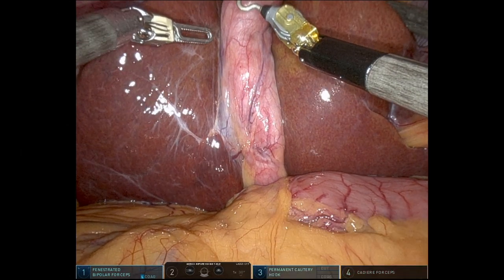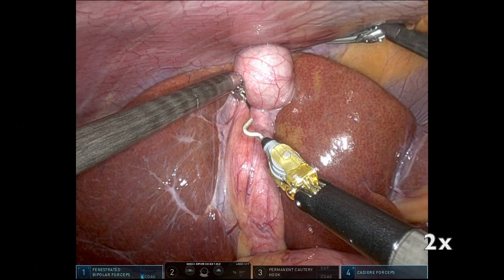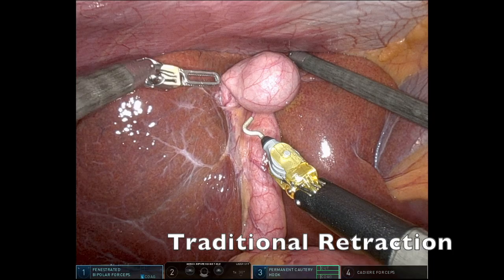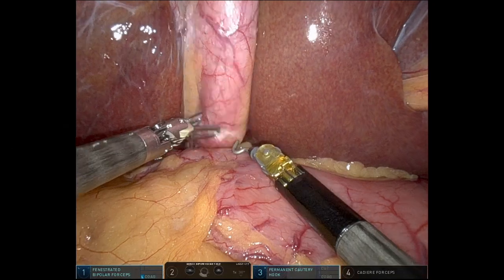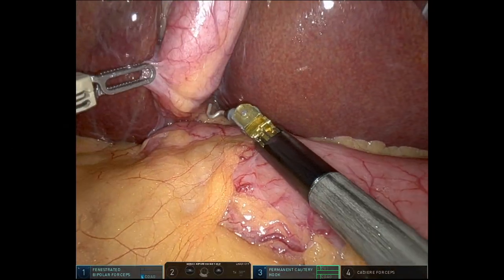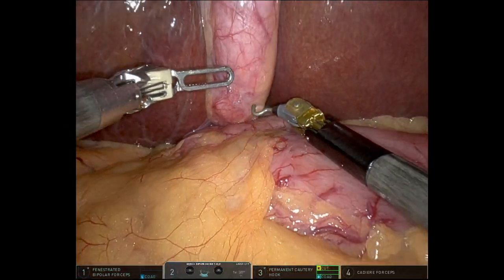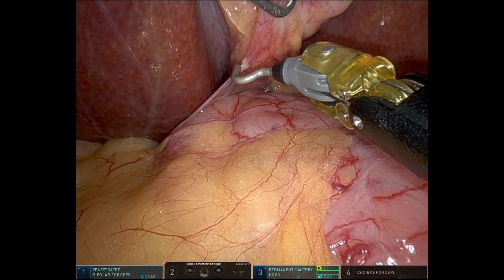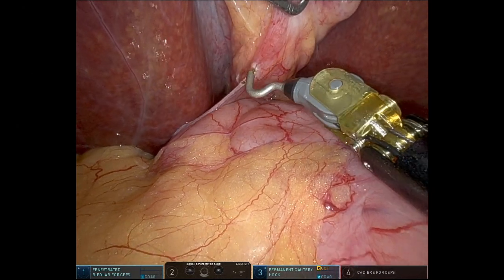Here's my fellow operating. He's grabbing the fundus, which didn't give him the best exposure since this was a very long gallbladder, so he grabbed a little lower on the gallbladder. You can see he's trying to do the traditional robotic cholecystectomy. He's going to start dissecting, but he had trouble exposing the triangle of Calot and seeing the medial part of the triangle of Calot well.